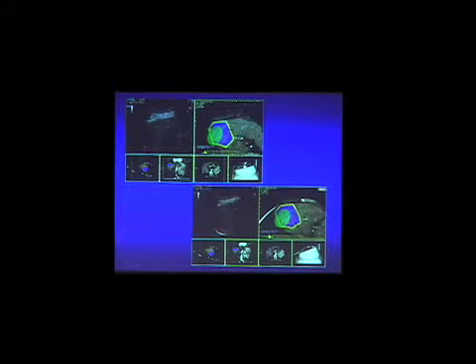Or in some cases, you should introduce, for example, two, in this case, microwave antennas, into this big lesion. But if you space your antennas too largely, this is useless because the middle portion will not be treated. If you introduce your antennas too close to each other, you again have not enough treatment because the external portion will not be treated. We know that 2 centimeters is the ideal spacing between the two antennas to get the maximum result. What can you do?